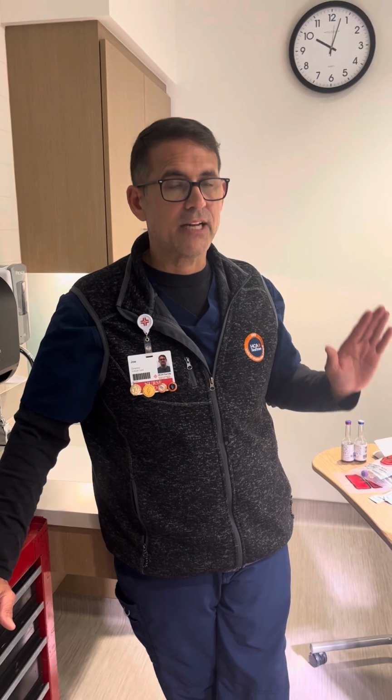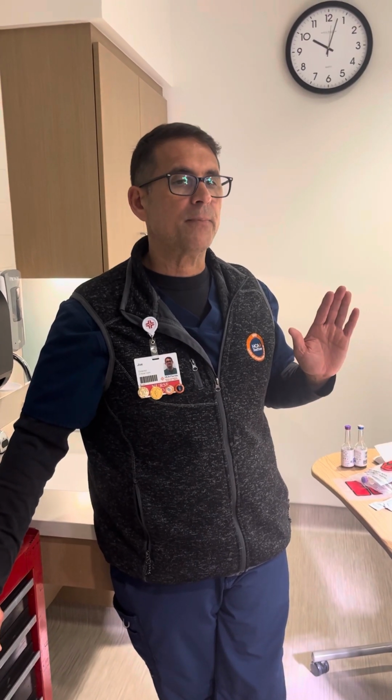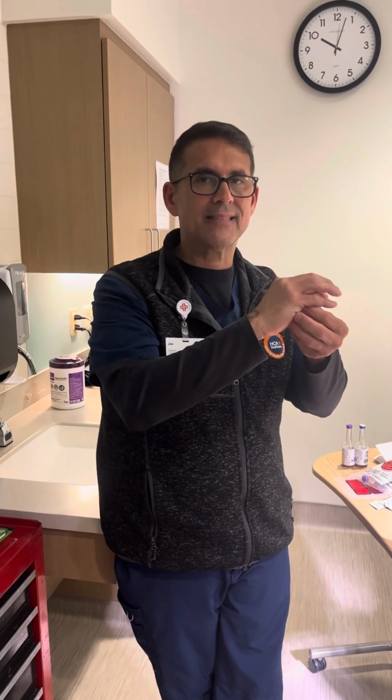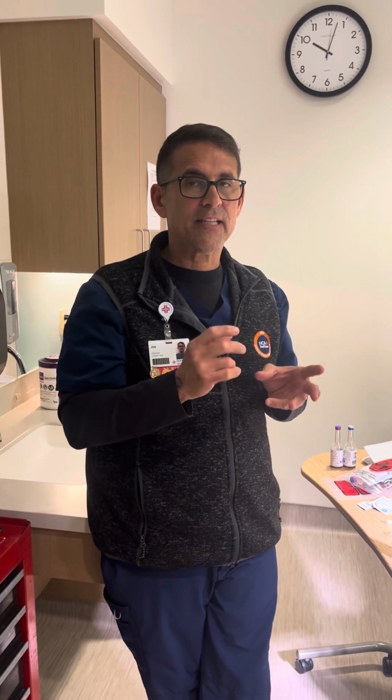And you cannot draw blood cultures when you're starting an IV. And I know that's a kind of a big deal, especially on these little babies. But when you start an IV, the IV catheter, the plastic piece, as it's going into the skin, grabs a bunch of skin cells and it can grab bacteria. So the contamination rate when you use blood from an IV start, average is 7% if you do everything right. If you use a needle, it's less than 3%. So it's a big difference when you're starting an IV.